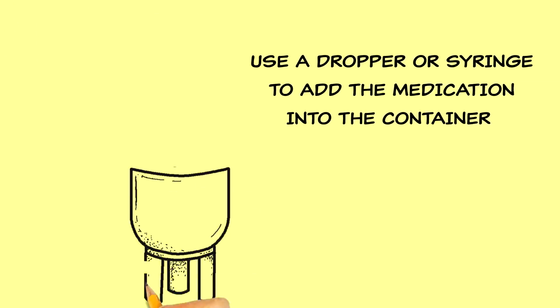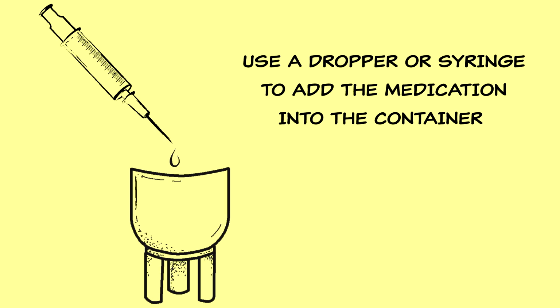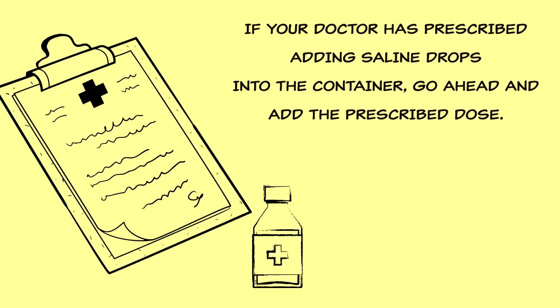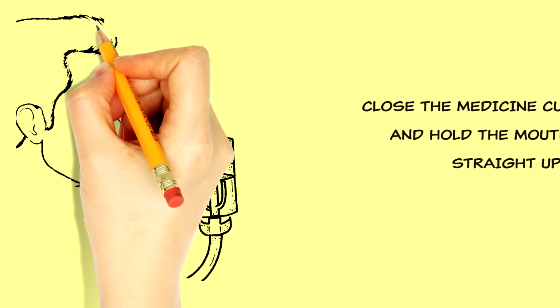Use a dropper or syringe to add the medication into the container. If your doctor has prescribed adding saline drops into the container, go ahead and add the prescribed dose. Close the medicine cup tightly and hold the mouthpiece straight up.